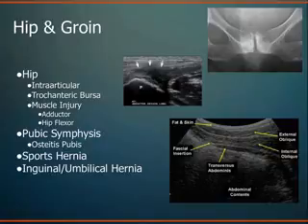Very easy injection to do under ultrasound guidance. You see exactly where you're going, the very superficial structures, as well as muscle injury. So here's an adductor muscle tear and associated adductor tendon. You see this collection of hematoma, tissue disruption, and retraction of tissue in the area of the tear.